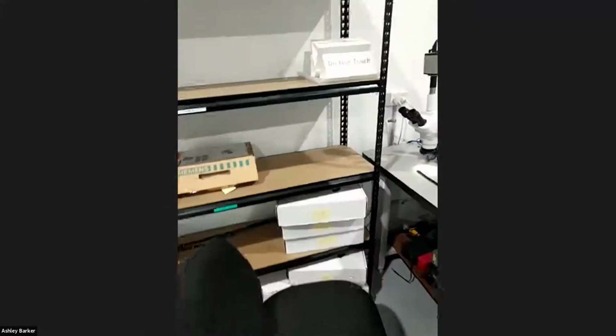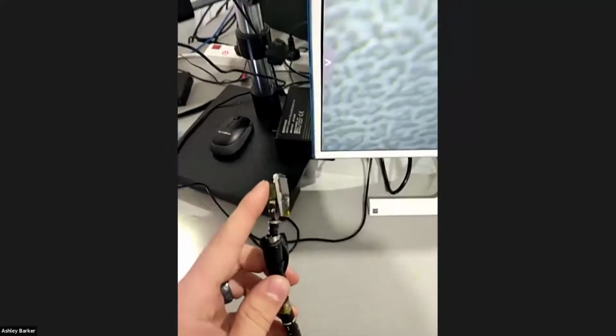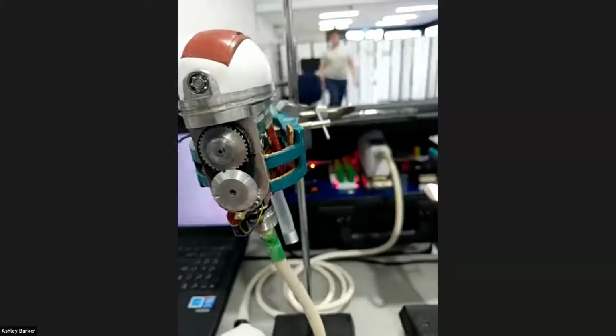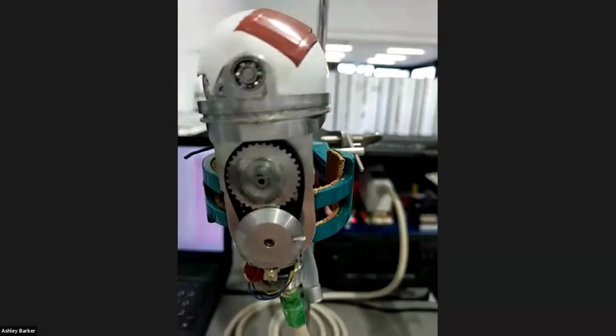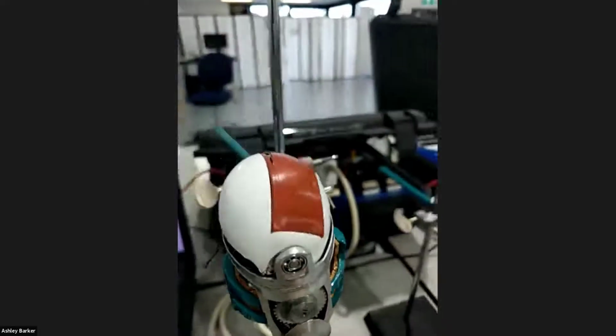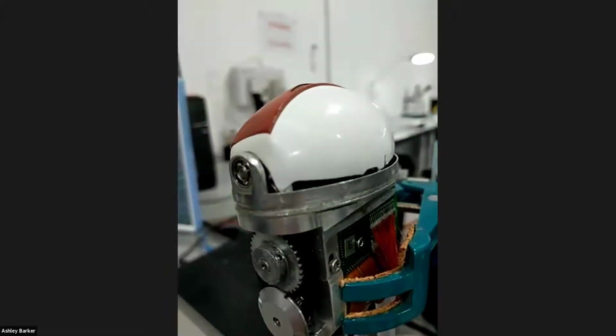I just got a correction. I said this probe had 4,800. There's actually 2,300 elements. I got that wrong. So just a correction. Still a lot. How many is in a standard point of care probe, for example, a standard linear? Probably anywhere between 128 to 256, something like that. Wow. So this probe is now running. You can see that mechanism driving that probe backwards and forwards. And obviously when the machine does it, it does it a lot faster than that. But that's basically what happens when they're scanning for 3D babies.